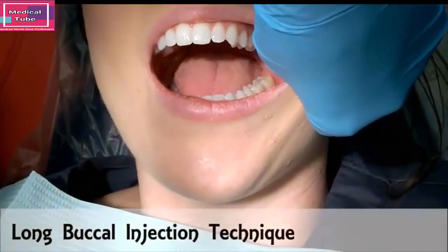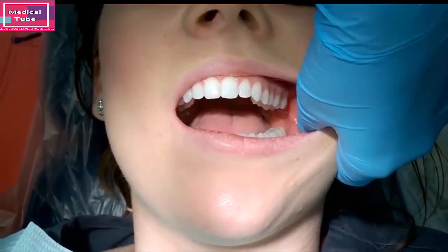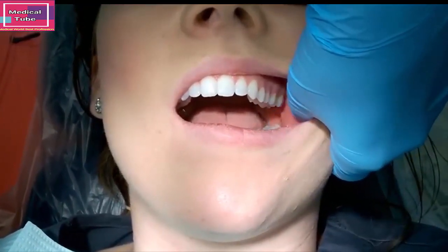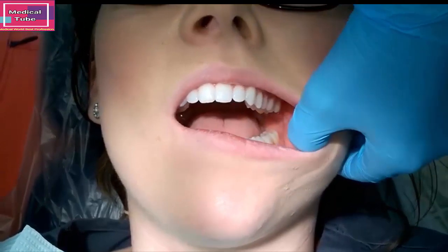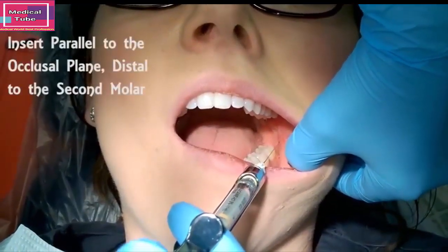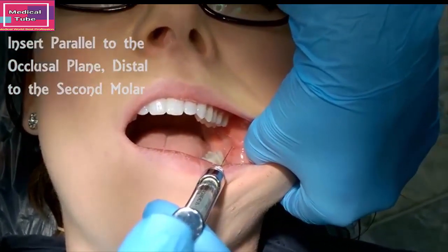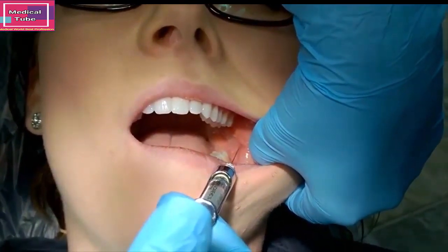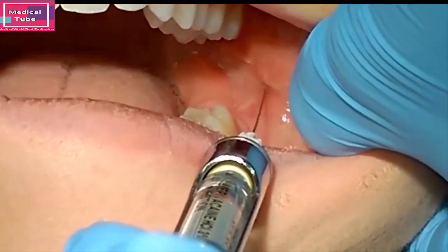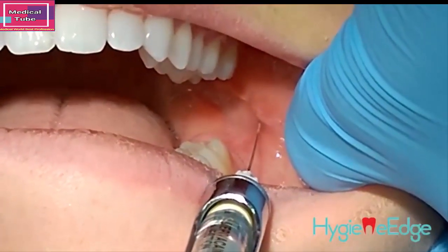When you give an IA, you also have to do a long buccal if you're doing periodontal therapy, because the IA does not innervate the soft tissues of the molars. So to give the long buccal injection, you take the needle parallel to the occlusal plane, hold the tissues tight, head straight back from the occlusal plane, and you insert about 3 to 4 millimeters in. You aspirate and then deposit about 1/4 of the carpule.